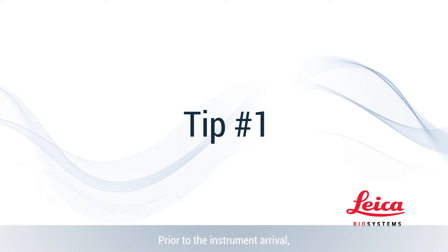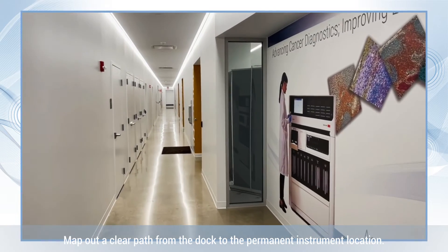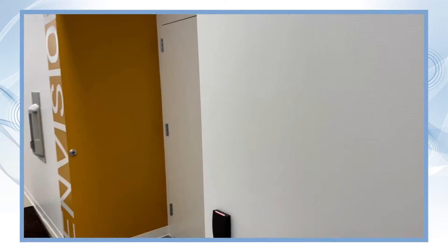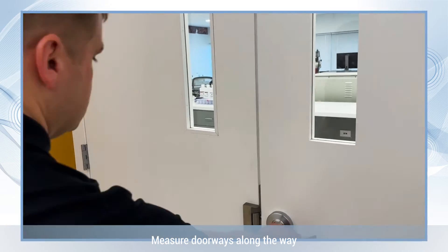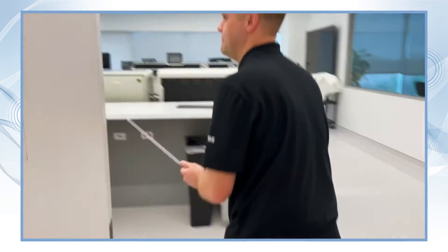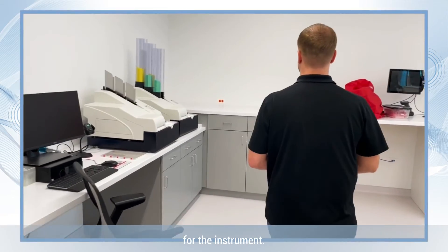Tip one is prior to the instrument arrival, consider the journey your instrument will take to get to the lab. Map out a clear path from the dock to the permanent instrument location. Measure doorways along the way, and ensure you have a dedicated power circuit for the instrument.